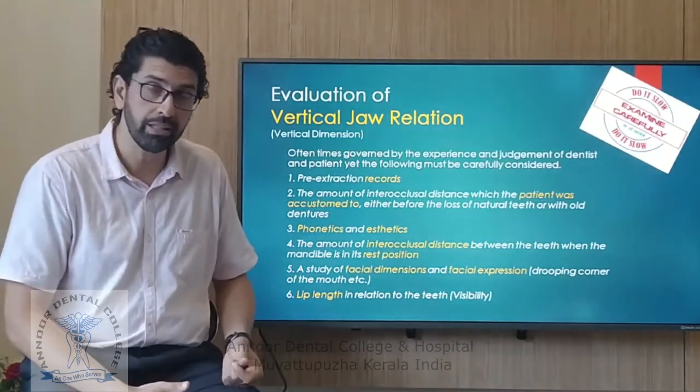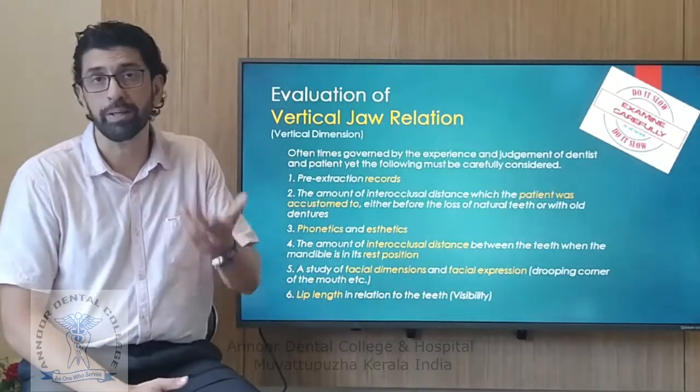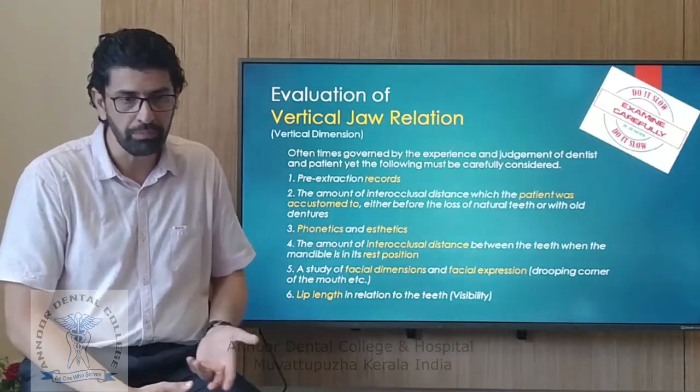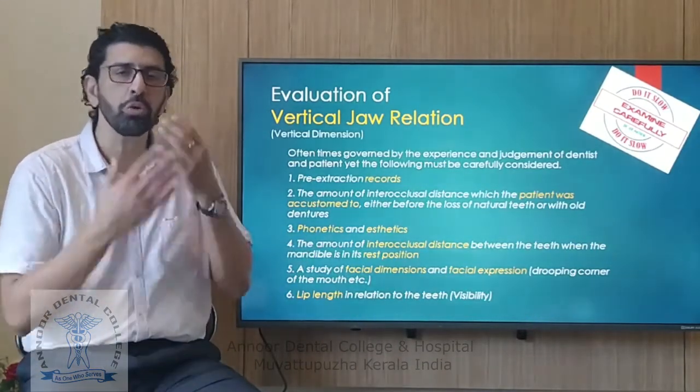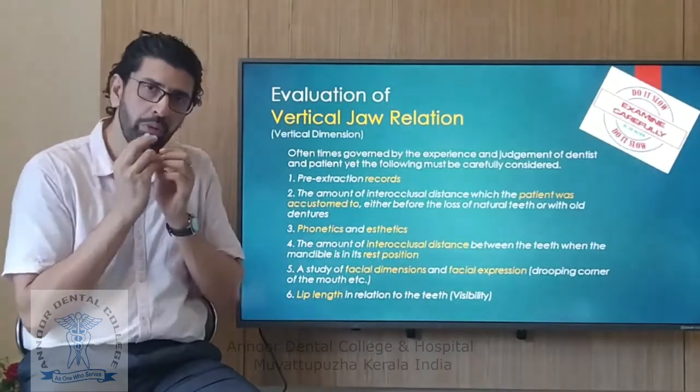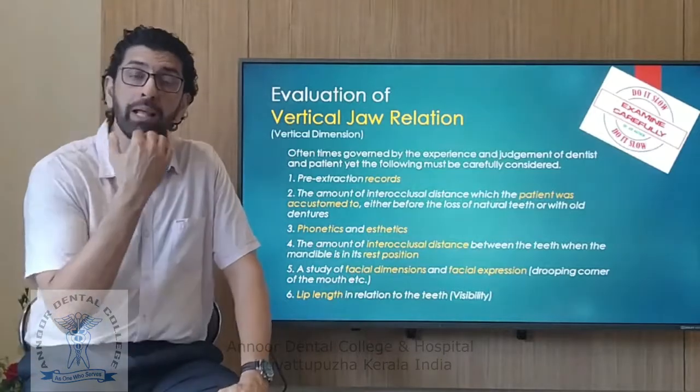Another one is phonetics and aesthetics. Does the patient's face look too stretched out or too dished in? How the patient speaks, is it clear or not clear? Then the facial measurements, right? How the facial expression looks, does it look like a drooping face because the vertical dimension is too low, or a very stretched out face? So these things you can check. Lip length with the anterior teeth.